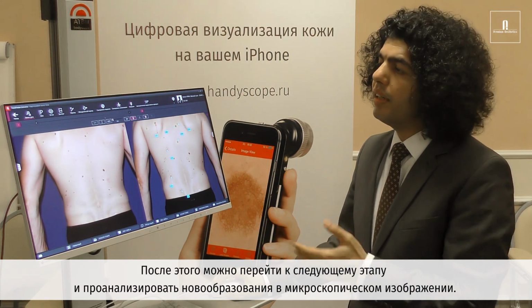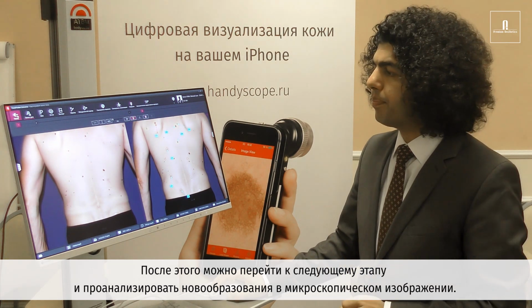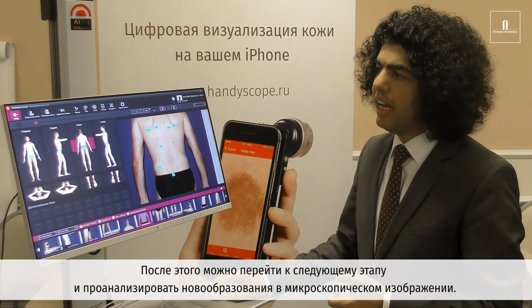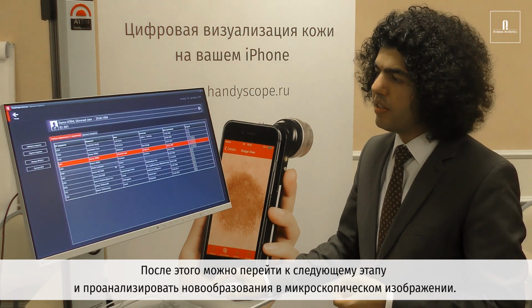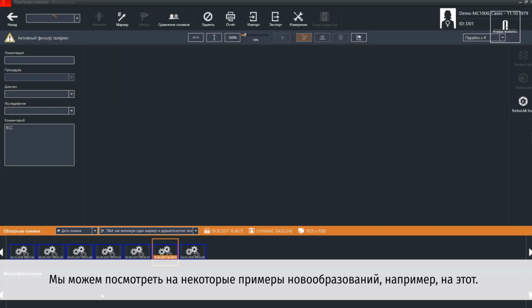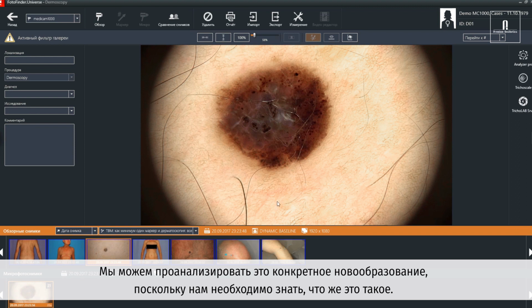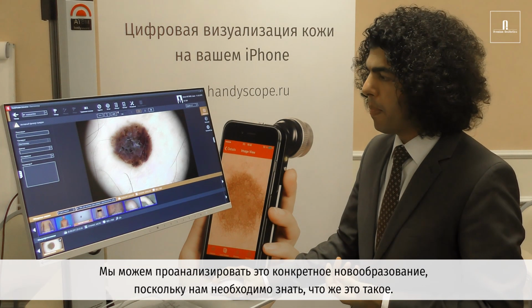Once this is done, you are able to go one step ahead and analyze the lesions in a microscopic way. So we have a look at some cases of lesions, for example this one. The picture of the lesion is taken and now you can analyze this single lesion because you are interested to know what this could be.